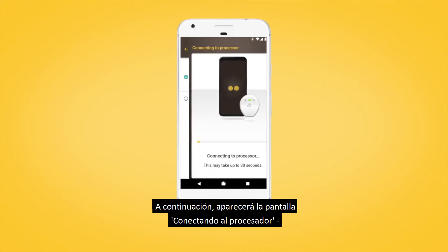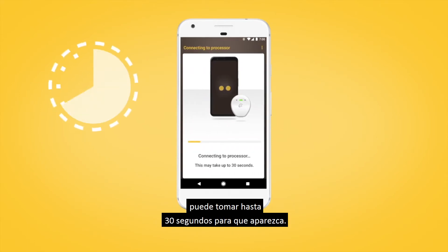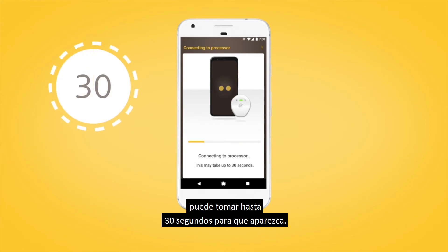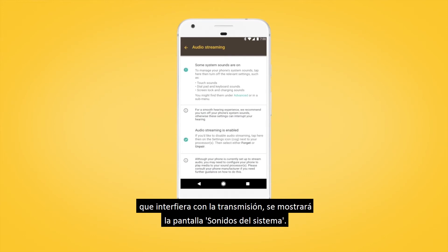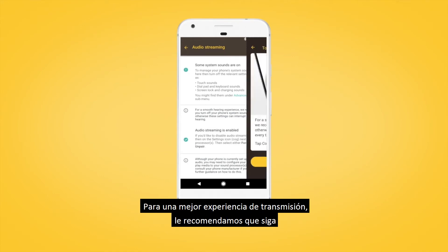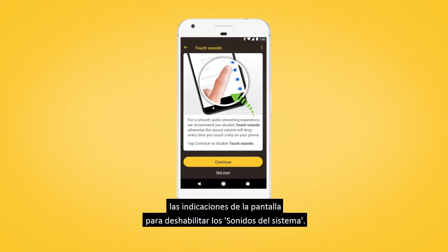The connecting to processor screen will then display. It may take up to 30 seconds for it to appear. If you have any system sounds enabled on your smartphone that will interfere with streaming, the system sound screen will display. For a better streaming experience, we recommend you follow the screen prompts to disable system sounds.